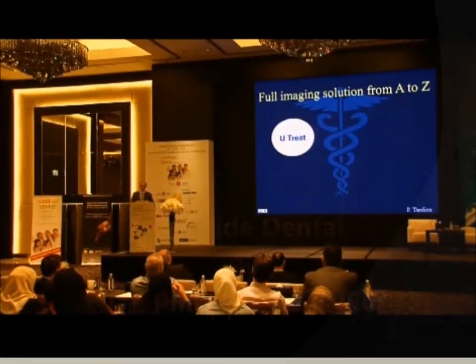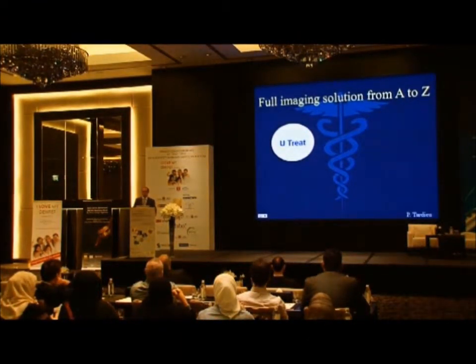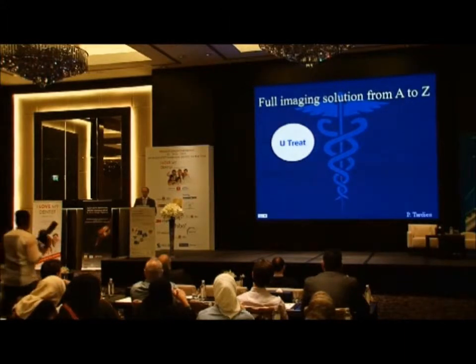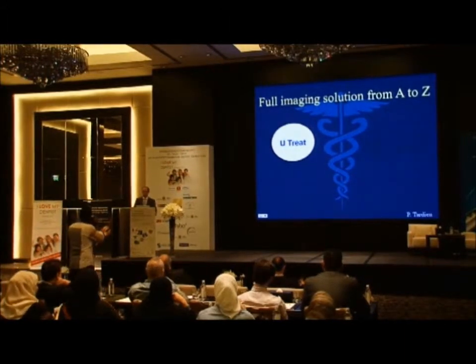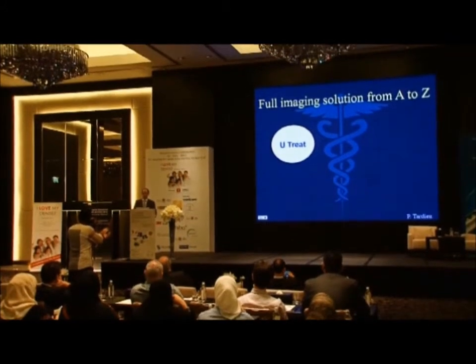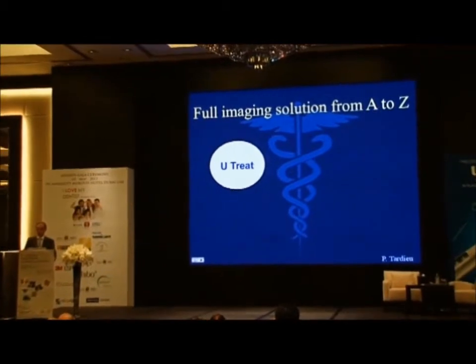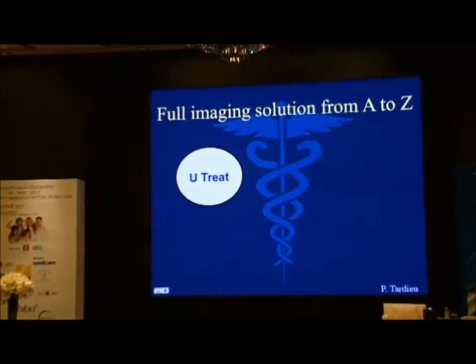So I've been working with a group of experts in France to set up a program allowing us to simply get all the solution from A to Z in computer-guided implantology. You will see that it's not simple, but we've been simplifying this in 3 modules.